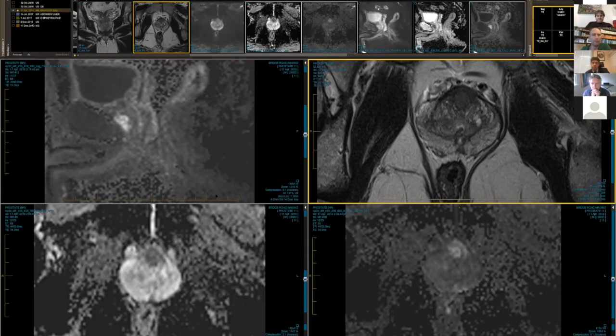Right. It's very interesting that you bring up focal therapy because, as we'll see further as we go through what Andrew shows us, obviously if you do focal therapy, then you really need to be very sure that you've just got the one focus, or at least that you know where the focus is. Roberto, just getting back to biopsies, how do you train up your residents in performing biopsy, and what do you use? Oh, as you know, Jeremy, we did transperineal biopsy since, I believe, 30 years.